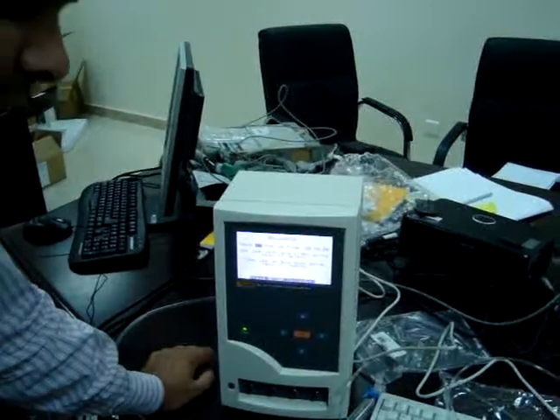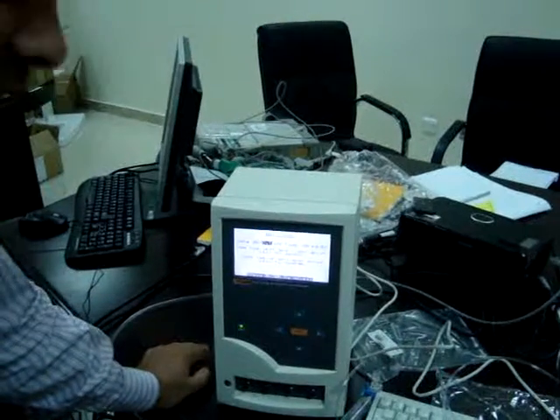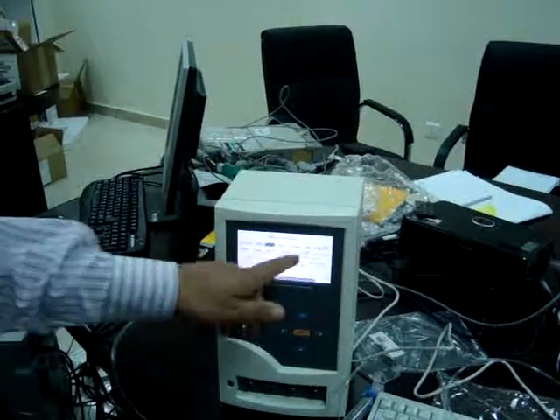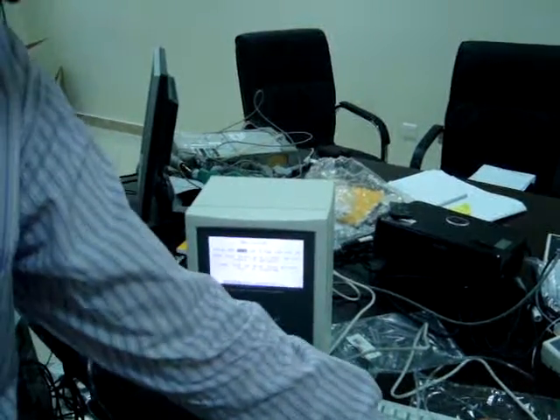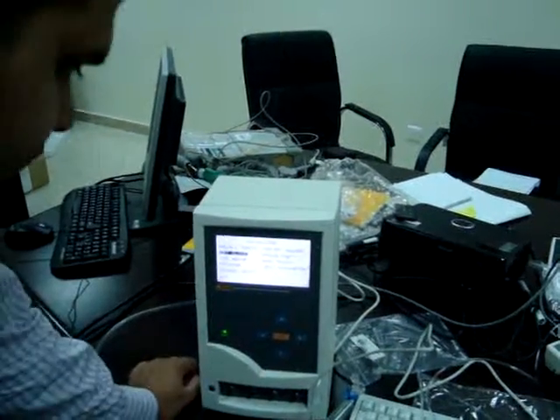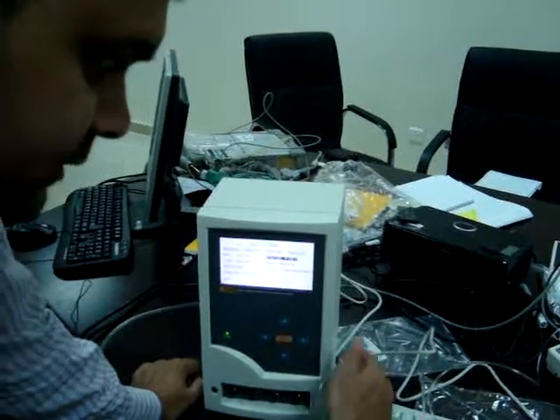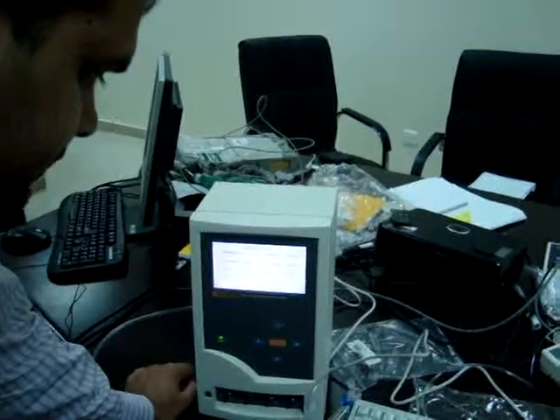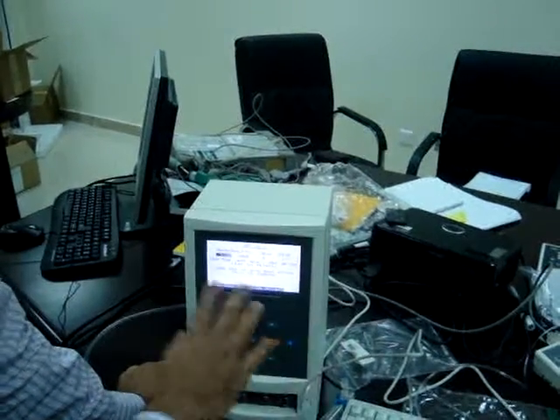This is to change up down, to move left right. When you go to the A1 menu, you need to reset the time again. And then you can do the port setup when you are connecting the printer. Your baud rate, parity, and all that as per printer specification.